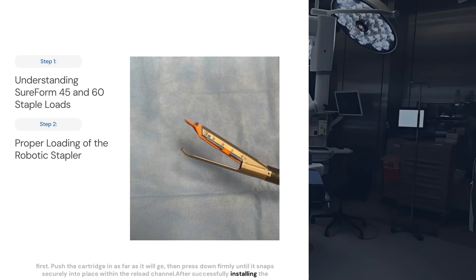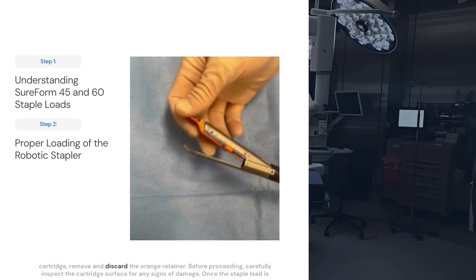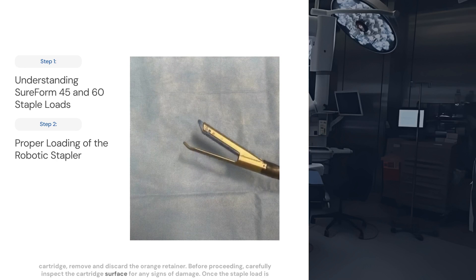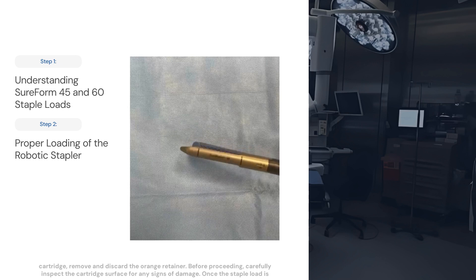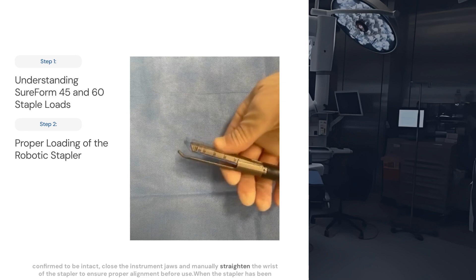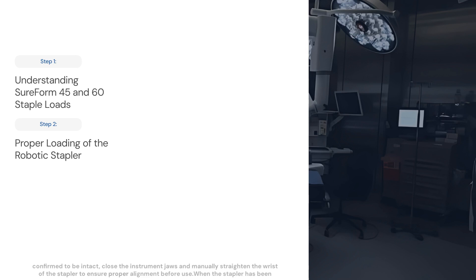After successfully installing the cartridge, remove and discard the orange retainer. Before proceeding, carefully inspect the cartridge surface for any signs of damage. Once the staple load is confirmed to be intact, close the instrument jaws and manually straighten the wrist of the stapler to ensure proper alignment before use.